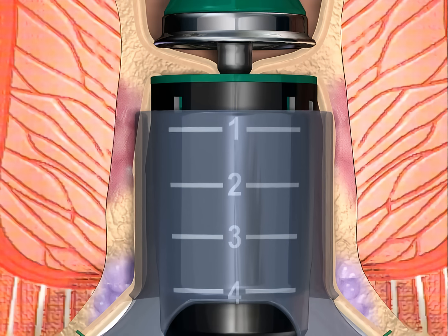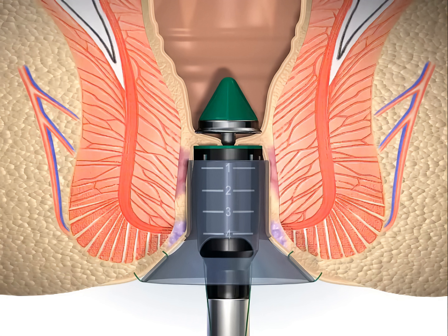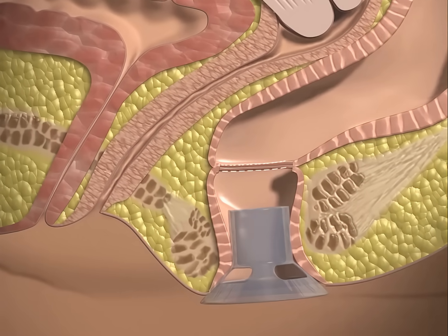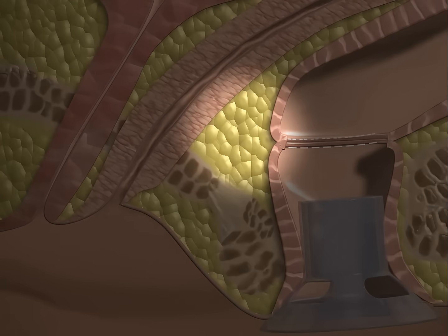The stapler is examined to ensure that it is aligned along the axis of the anal canal. Prior to firing, the 4 centimeter mark on the stapler casing is positioned at the level of the anal verge, placing the staple line at the proper height. If the patient is a woman, check the posterior vaginal wall to be certain that it has not been incorporated in the staple line.